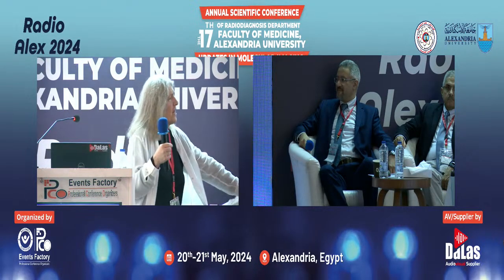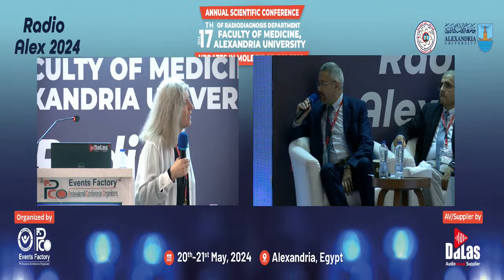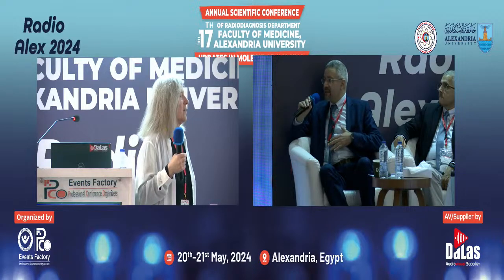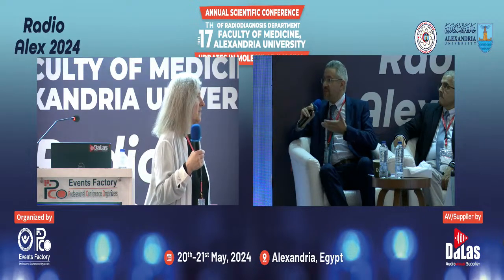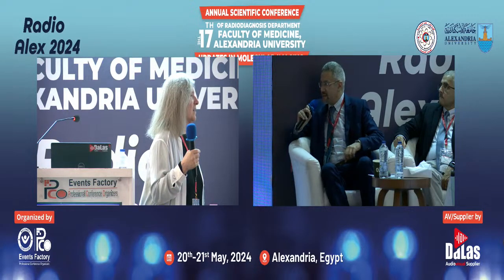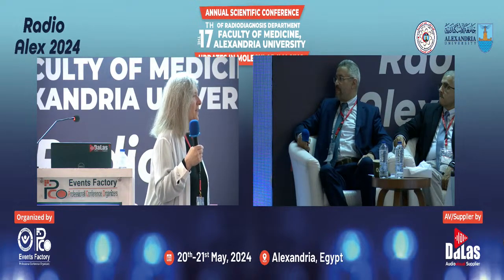And I couldn't understand your second question. I'm sorry. Regarding post-nephrectomy for RCC, do you recommend using PET-CT as a survey or screening for metastasis? This is my little experience. Is it the first line you recommend? Because we found a lot of strange sites for deposits. Is it a satisfactory study to cover the whole body, or do you recommend other studies? Yeah, I would agree with that, yes.